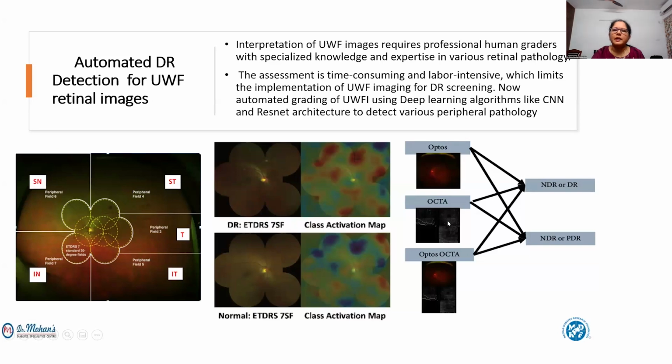Some of them have combined it with, as Dr. Rajiv spoke about, multimodal imaging. They combined photography with OCTA and then provided outputs as to whether it is PDR or NPDR or no DR, etc., based on both photography as well as OCTA merged as multimodal images.